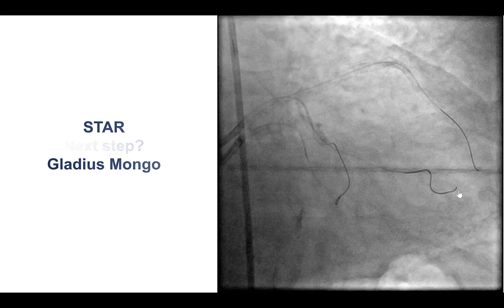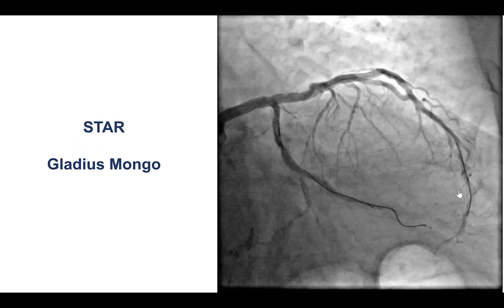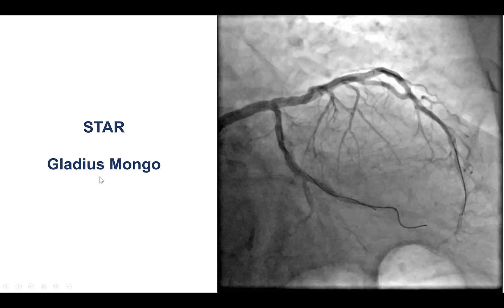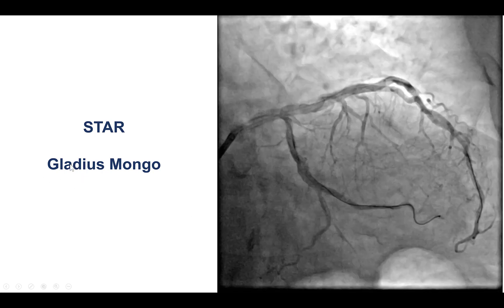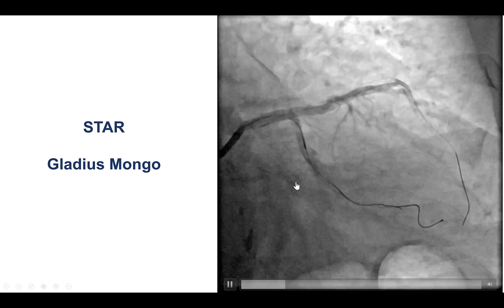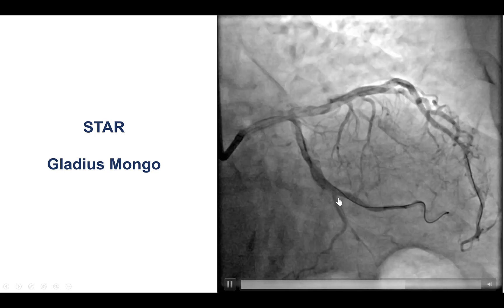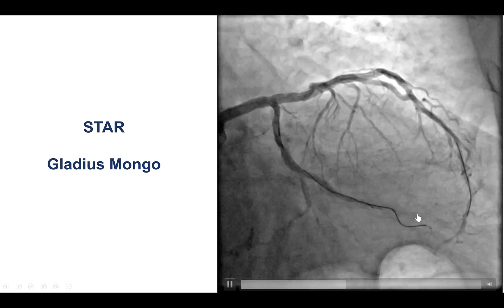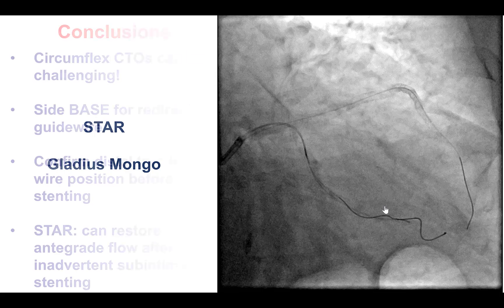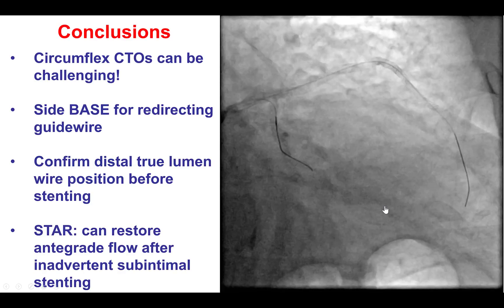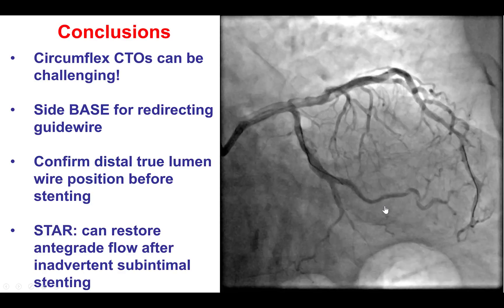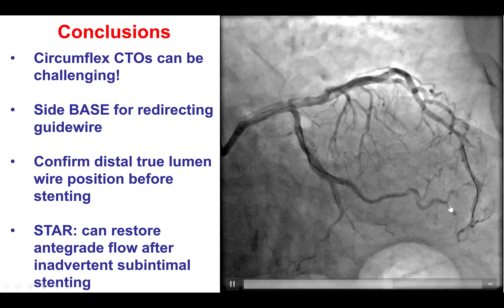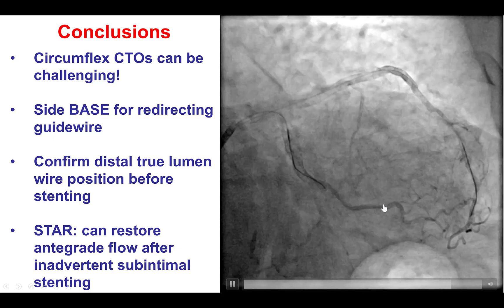At this point, we decided to use the STAR technique. We used a polymer-jacketed stiff wire, the Gladius Mongo, and after multiple passes, we were actually able to restore anterograde flow into the superior branch of the obtuse marginal and obtain a satisfactory final result, although there are still evident dissections within the course of the vessel.